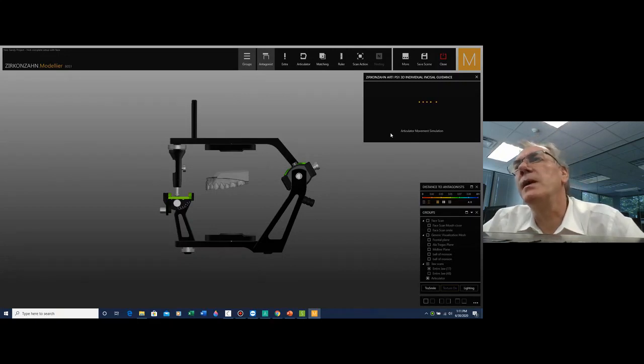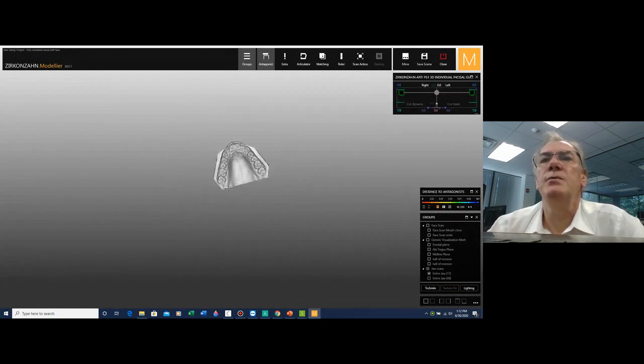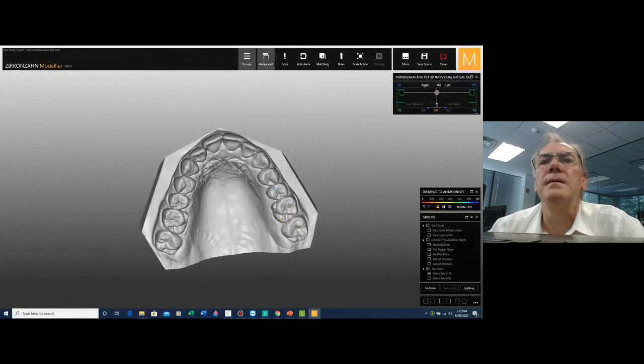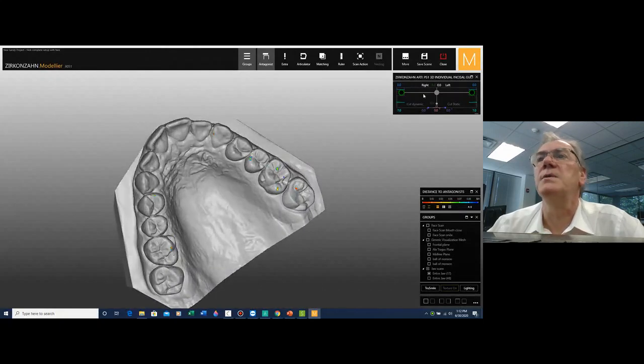So just bear with me. But at the end, it's just important that we understand and we get a feeling of what it really means to perform some functional evaluations. I also do believe that it's the foundation which helps us solve a lot of problems in the prosthetic world.